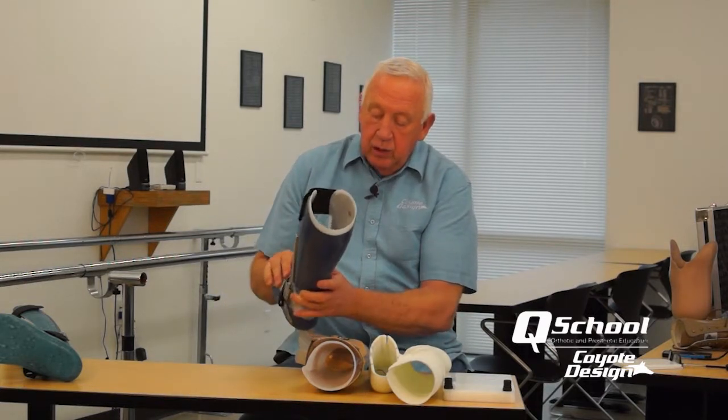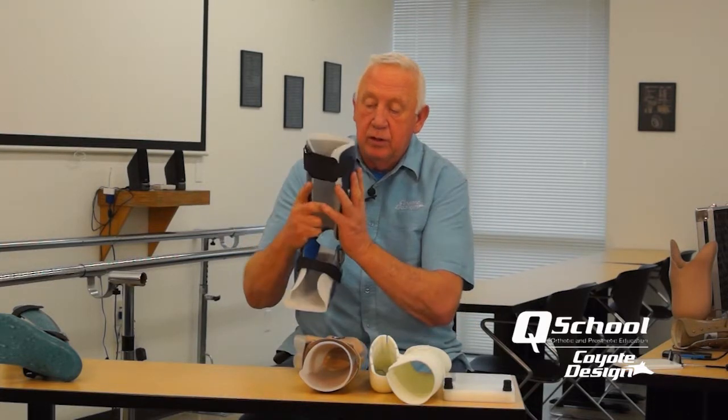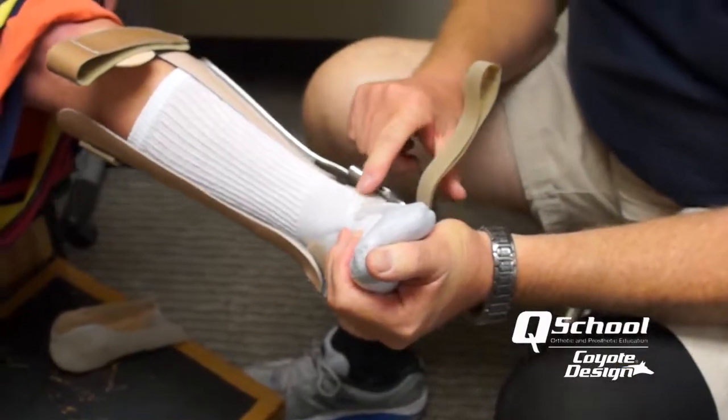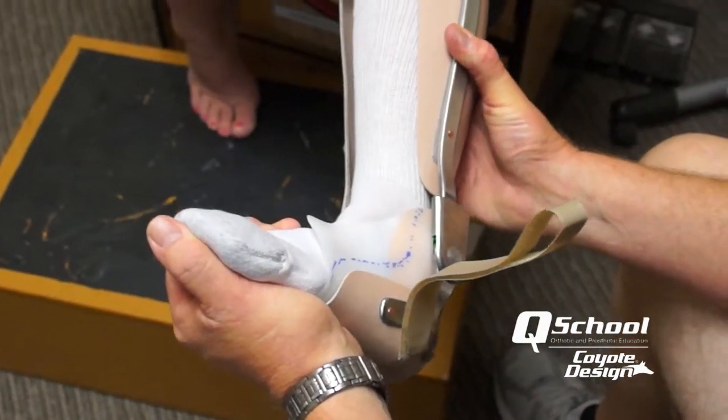The design includes a molded inner boot to get a really good grip on the foot and add maximum comfort. It also features a tapered shape design so that when it's on the patient's limb, the taper helps de-weight the arthritic ankle and assist with pain management as well.